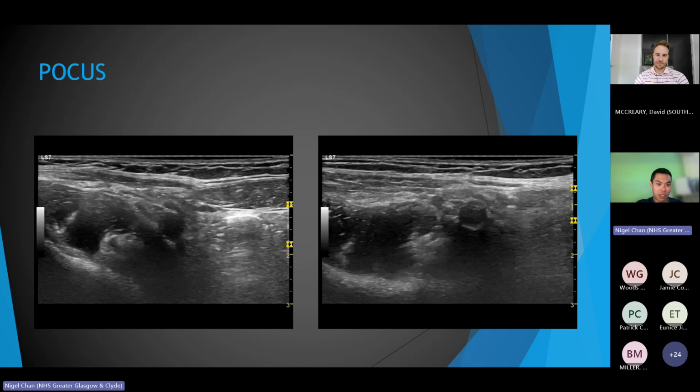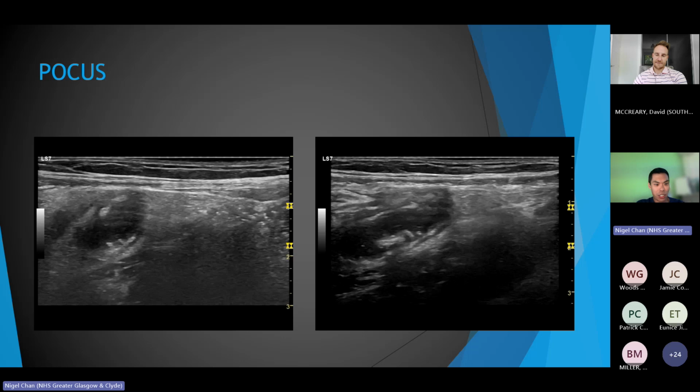I think it comes back at the end. There, there's a massive circular structure here, which shouldn't be normal. And everything looks a bit bright surrounding it. So I just moved a bit closer to have a closer look at that. And you can see here, this is basically what an inflamed appendix looks like.